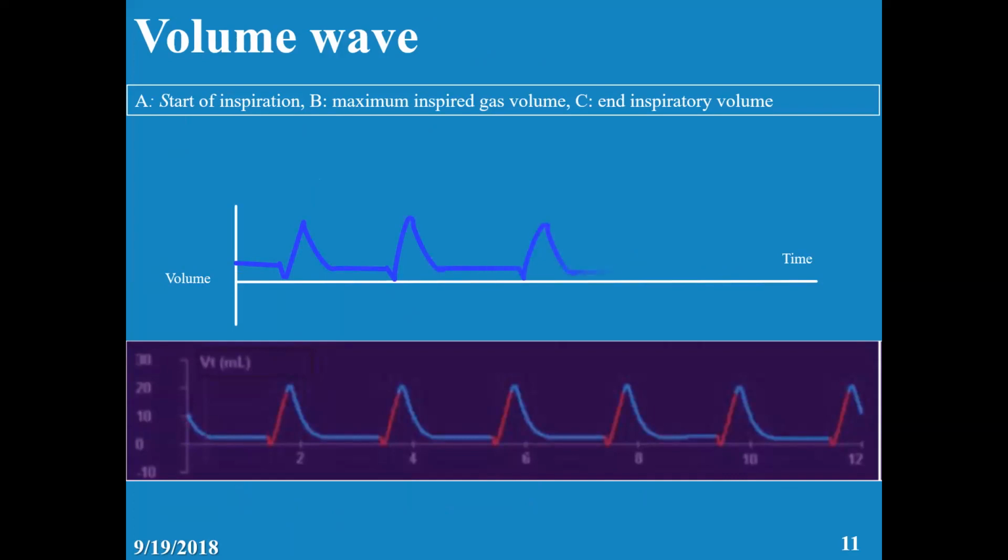Now, if you look, some ventilators show you 2 colors. One color is the patient contribution, and the other color is the machine contribution. It's very important because sometimes it's difficult, and this makes life easy. If there is no patient contribution, this is a mandatory breath; if it's mixed contribution, it's an assisted breath; and if there is only the patient color, it is a spontaneous breath. So this is the advantage of some ventilators. It shows in color. Okay, is that clear?